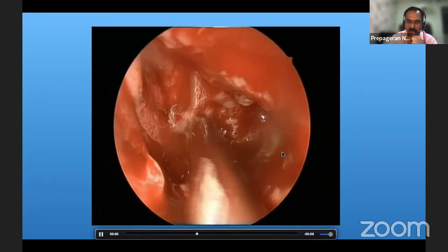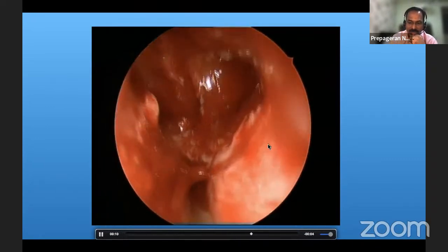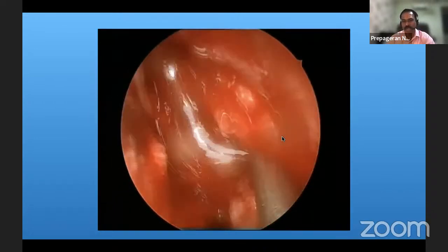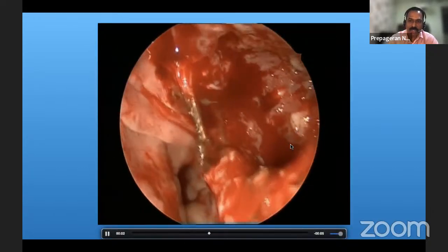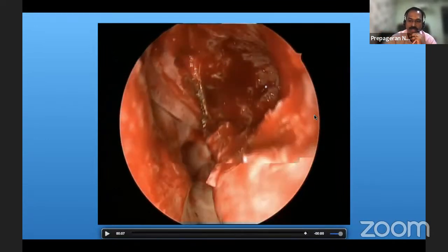As you can see, you will definitely have bleeding. 1 year of infection with self-treatment with antibiotics. And then I use a ribbon gauze to remove all the granulation tissue from the maxilla itself. That's how large the maxilla is, and remove the granulation tissue from the maxilla.